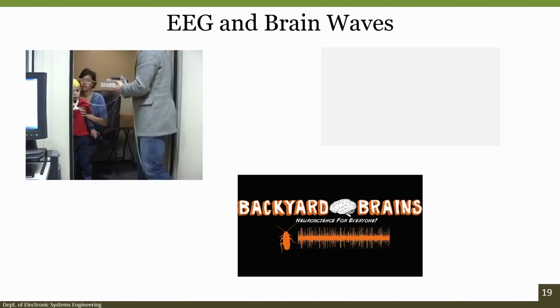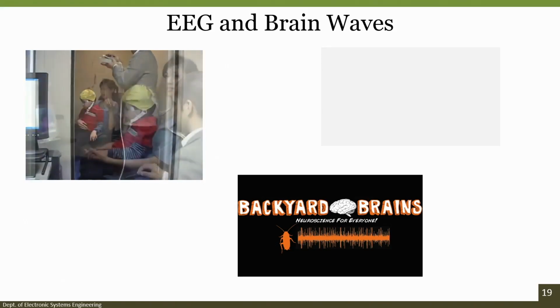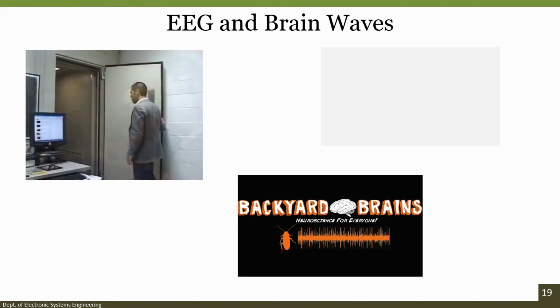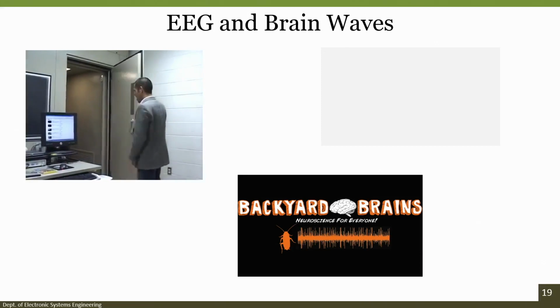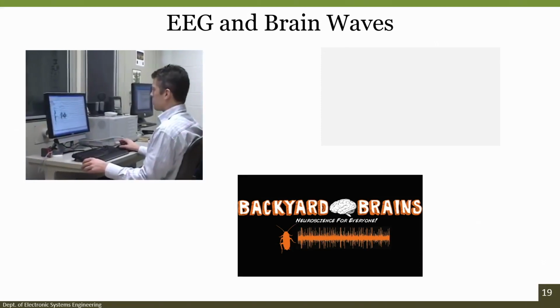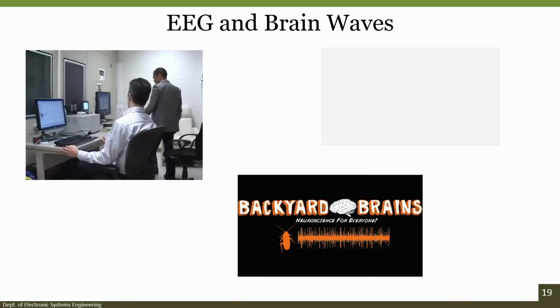I got to go into the sound booth with him, which helped him feel relaxed. I thought it would be hard to help him stay still, but the room was calm and quiet, and we just sat and watched the cartoons. Inside the study chamber, it's dark and quiet, and you'll get to watch another cartoon. While you're watching this cartoon, it's important to be very still and very quiet.